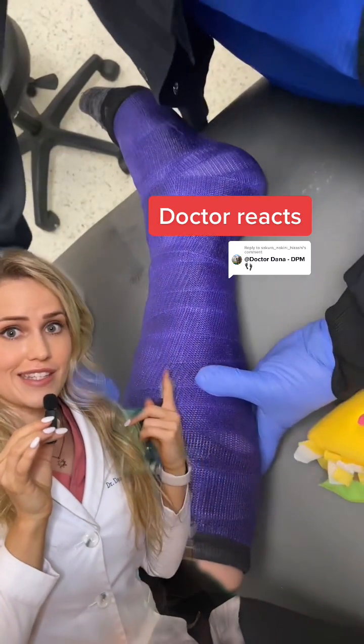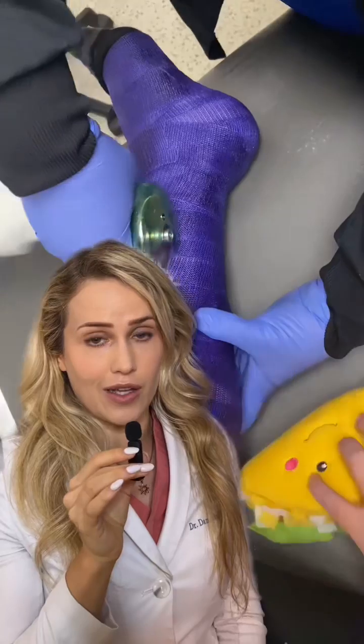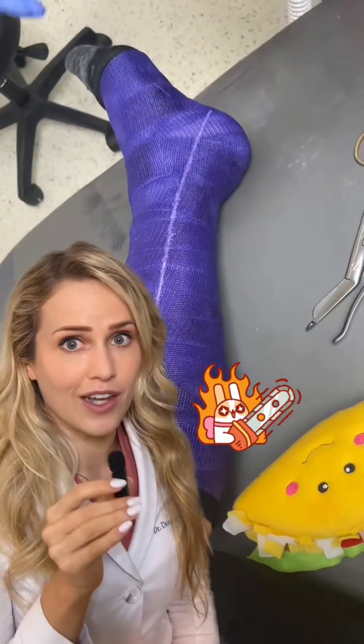Do you know the secret of these cast cutting saws? They're actually not like regular saws. A lot of people are really scared of them because they think they'll cut their skin, but that's not true.